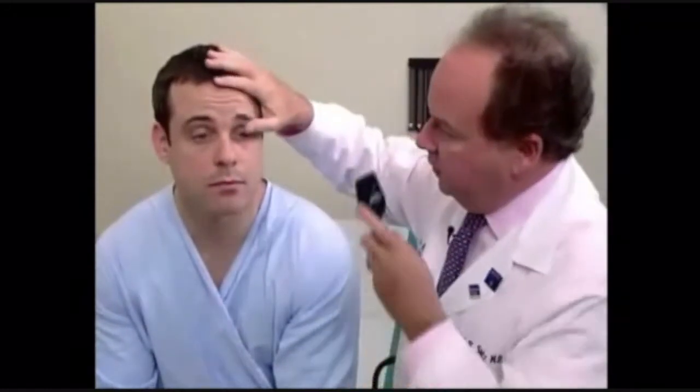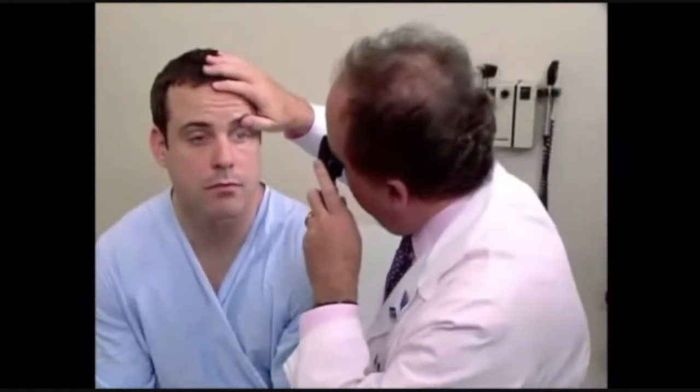We repeat the same procedure on the left eye using your left eye and holding the equipment in your left hand. And again, I'm about 15 to 20 degrees off of midline, and keep looking in the distance. And as one gets closer to the patient, the diopter wheel focuses first as we go through the cornea, the lens, the vitreous, and now the retina. The optic disc is well visualized, as is the vasculature.